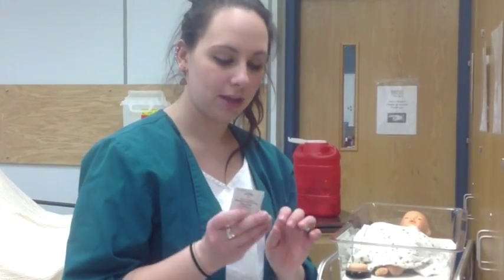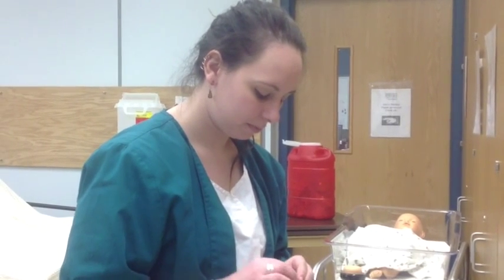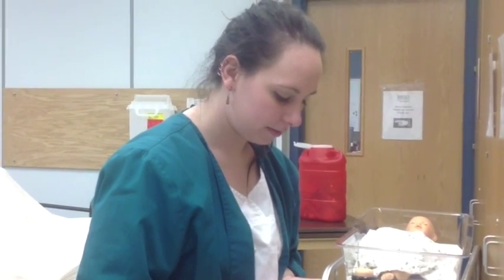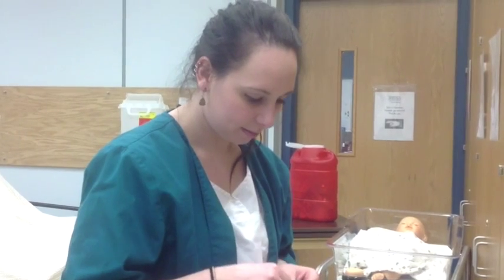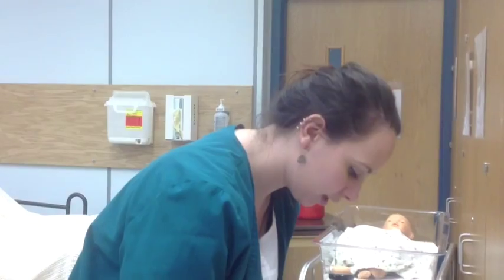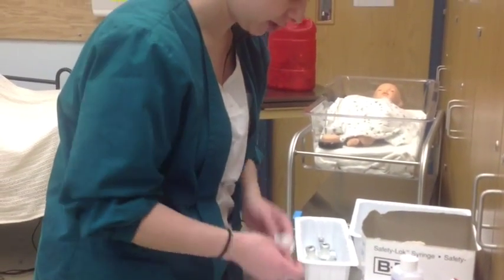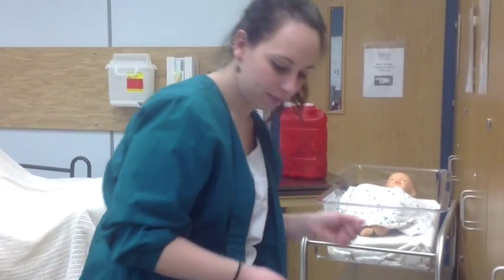So I'm going to now use an alcohol swab. And we're just going to clean the top of the vial, if I can get it out of the package. Clean the top of the vial. You want to make sure that it's sterile and clean. Germs, dust, you don't want that on your syringe when you go to give an injection.